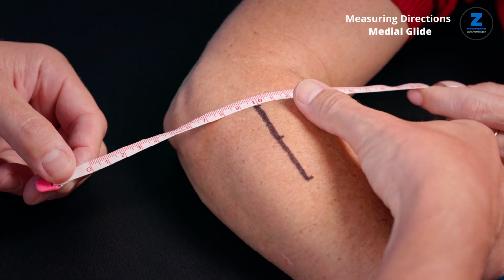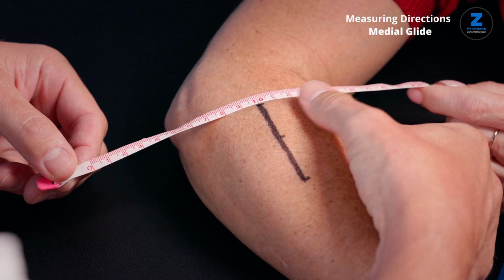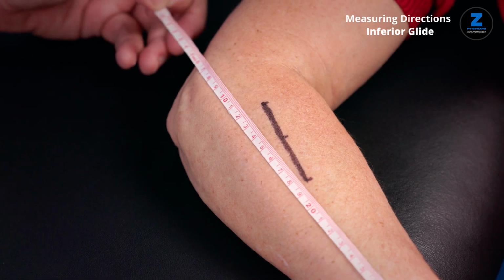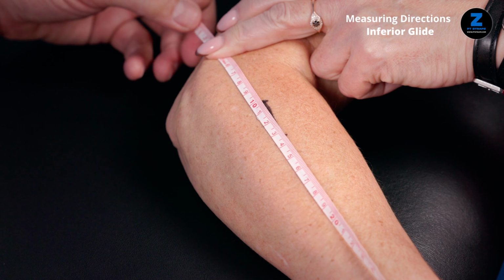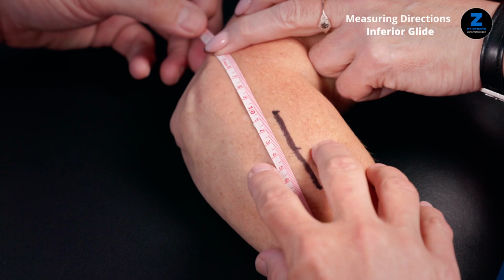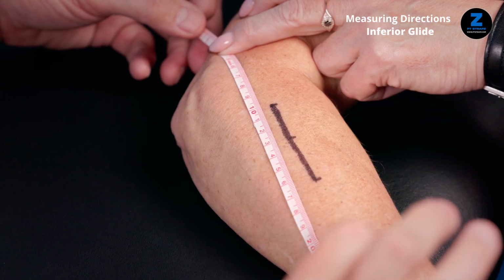And then we're going to go medially. I'm going to pull it over and pull. You can see, let's say 1.5, a solid 1.5 centimeters for a medial excursion. So now that's our medial and lateral, and we're going to do superior, inferior. And if you don't mind, hold it right there. Okay. So now I'm going to pull inferiorly. Okay, pull. You can see that's a solid 1.5 centimeters for inferior glide.